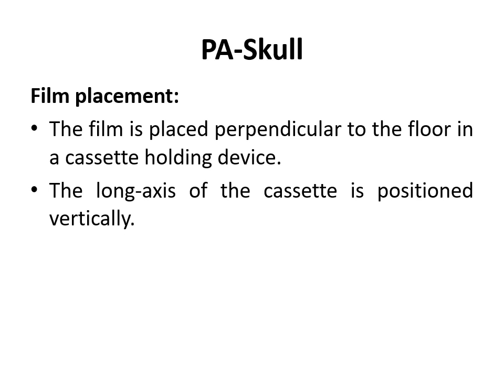PA skull, postero-anterior skull view. For every projection for extraoral technique, three things are important. First one is film placement, the second one is position of the patient, and third one is the direction of the central ray. These three are very important for every extraoral radiographic technique. First, let us discuss the film placement in the case of postero-anterior skull view.